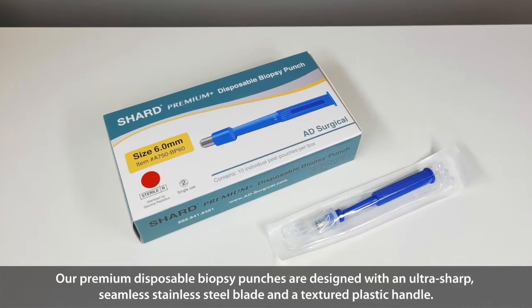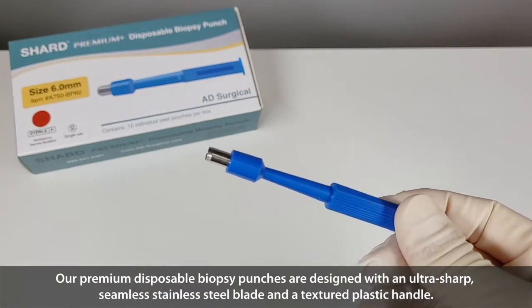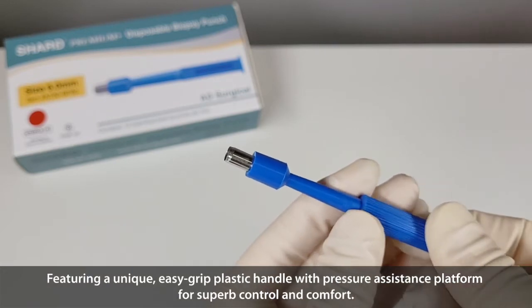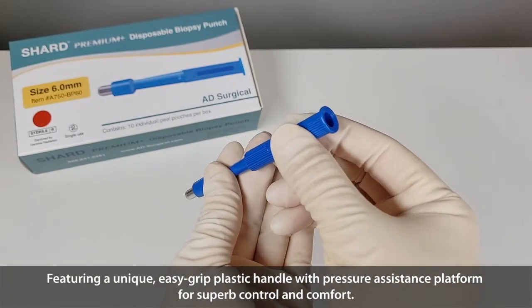Our premium disposable biopsy punches are designed with an ultra-sharp, seamless, stainless steel blade and textured plastic handle. Featuring a unique, easy-grip plastic handle with a pressure-assisting platform for excellent control and comfort.